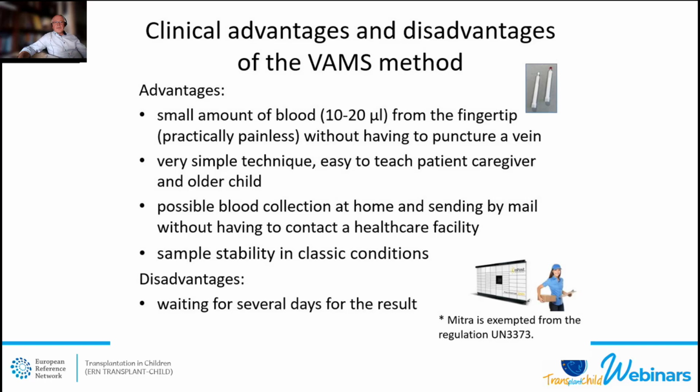It's also very important that blood collection is possible at home and sent by mail without having to contact a health care facility. This shipment is legal because Mitra is exempted from regulation UN 3373, so you can post it without any problem. And the sample is stable in classic conditions. The only clinical disadvantage is that we have to wait a few days for the result.